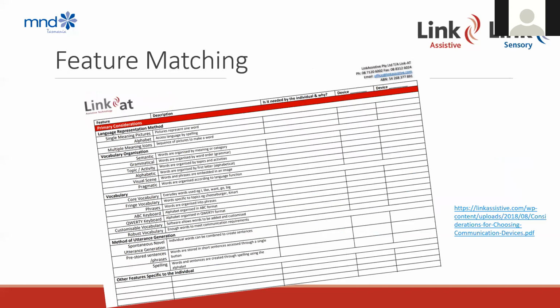One other document that I just wanted to draw your attention to before we delve too much further into the specific equipment that's available is this document that's available through our website, which is a feature matching document. So obviously we're going to talk through lots of different options today. And one thing that you guys as therapists will have to do is make that decision about what the best option is. And the process that we use to do that is referred to as feature matching. And this is just a tool and a resource that you can use to help guide that thinking, give you a little bit of a framework.